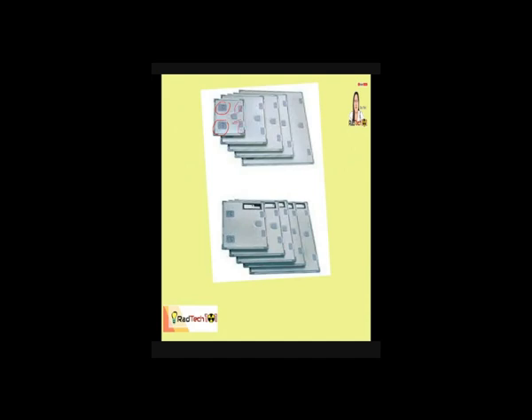This is the latch. But this one, the square one here, this is the marker or the lead marker of our radiographic cassette. The purpose of that is for the placement of the patient's pertinent information.